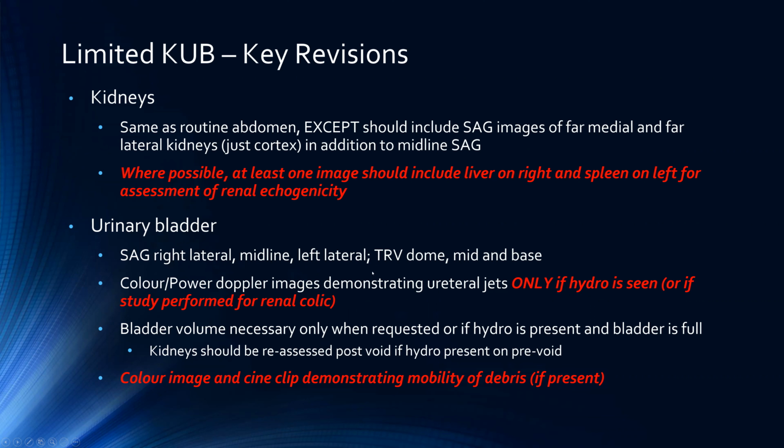Otherwise, no need to sit around waiting for ureteral jets. It doesn't really add much from a positive or negative predictive value to our examination. Even in the setting of renal colic, the absence of a ureteral jet doesn't necessarily mean anything.